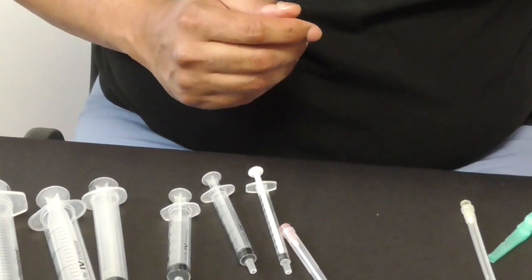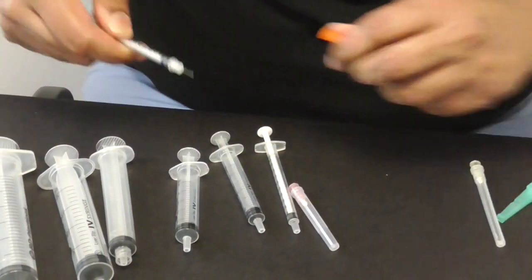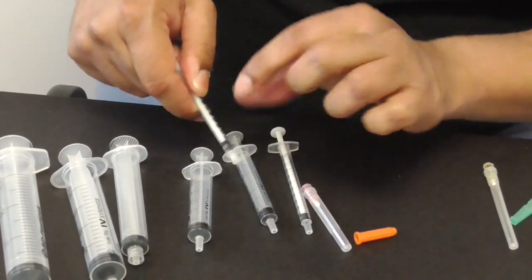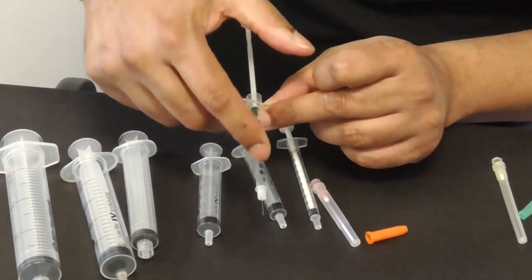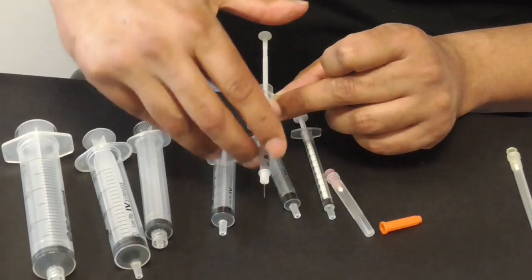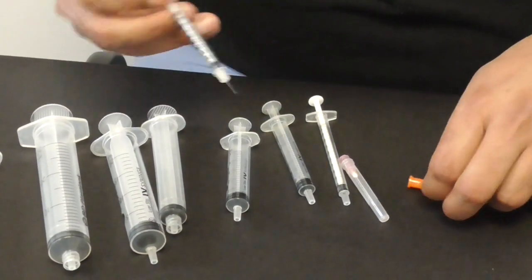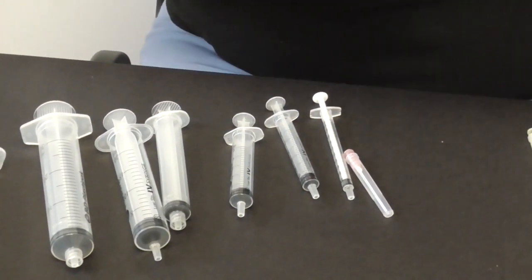Then there's insulin syringes and the insulin syringes actually have an inbuilt needle so the needle's an integral part of the syringe and it goes up to a much smaller calibration. It gives you units of insulin as you're drawing up and the needle is very very fine indeed. And this is for diabetics when they're injecting themselves with insulin.